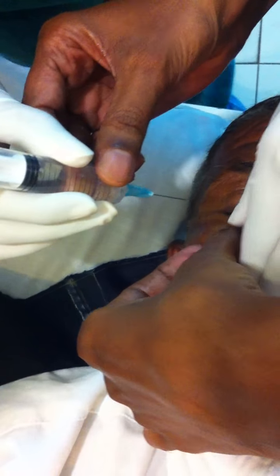Feel the bony orbit here. Don't push the eyeball — no, no, don't move the eyeball or anything.